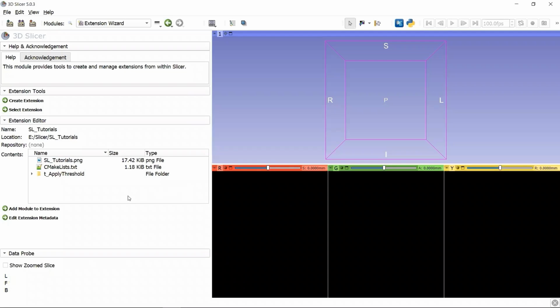You can find the file structure of our extension here. One CMake file to help the 3D Slicer to load the extension, and one image file for the extension. I'm not sure where this image is used, please leave me a message if you know where it is used. And here is our module folder, t-apply-threshold. Let's unfold this folder to check what's inside.